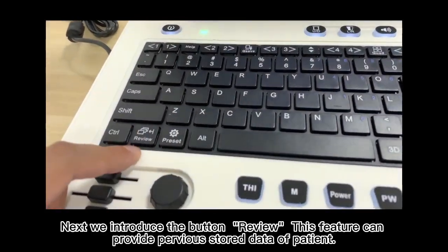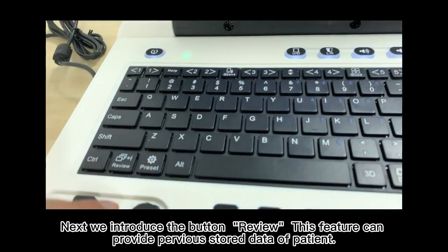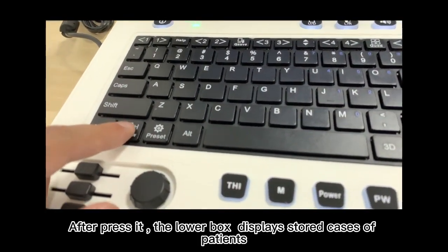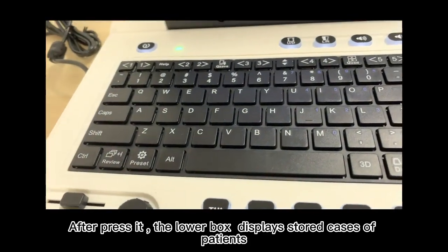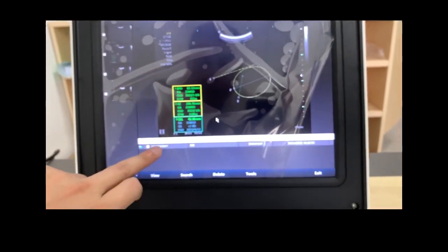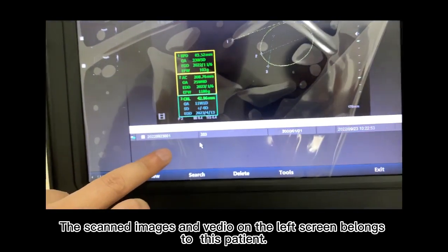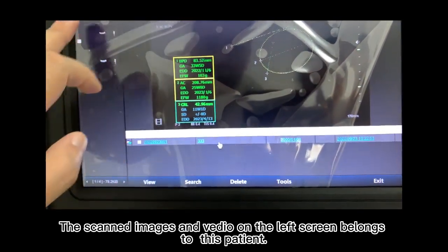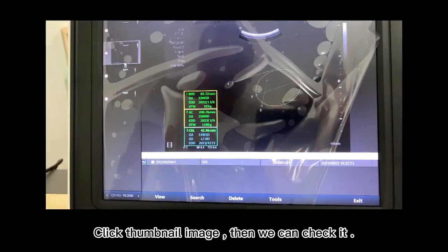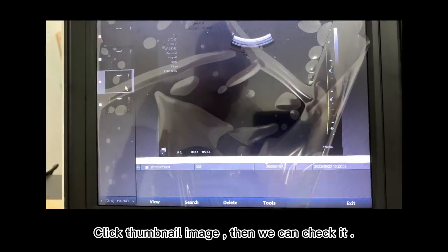Next, we introduce the button review. This feature can provide previously stored data of the patient. After pressing it, the lower box displays the stored cases of patients. The scanned images and videos on the left screen belong to this patient. Click a thumbnail image, and then we can check it.